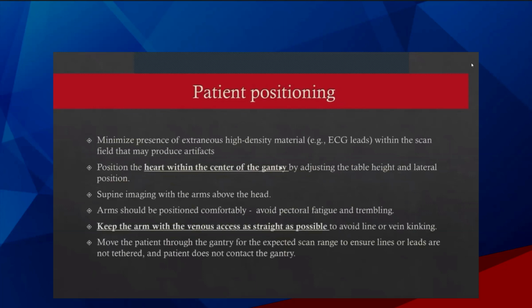Also, you want to minimize any artifacts that may be in the way, such as high density material, such as leads within the scan field. Most of the time, the leads won't be in the way of your heart field of view if you place them in the correct areas. So that's normally not a problem, but you also want to make sure that there are no artifacts that are going to obscure the anatomy or anything else that you're trying to look at.